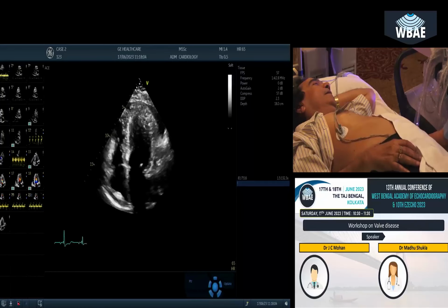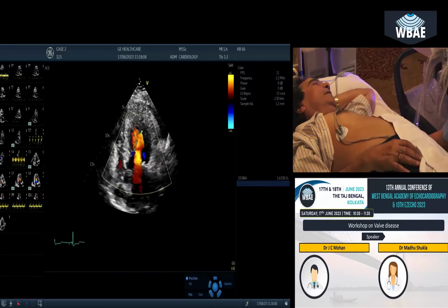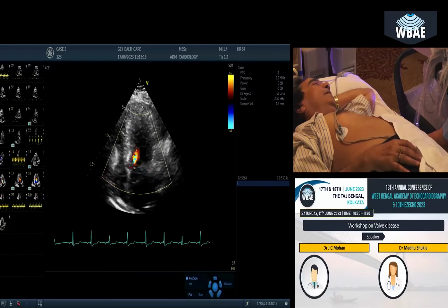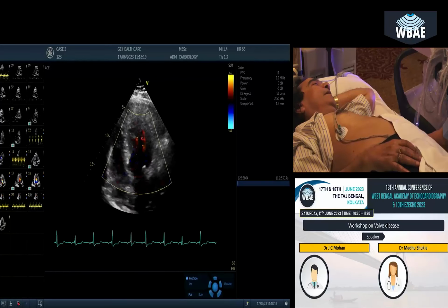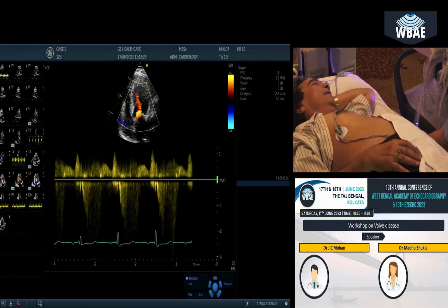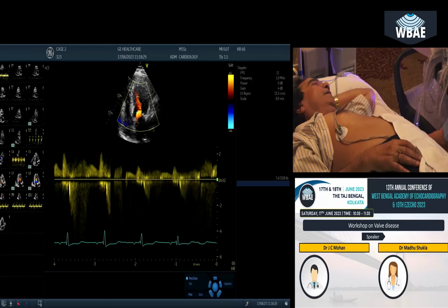Okay. Then, we have seen crypts, we have seen a transmitral flow pattern. Show us any gradient, continuous wave Doppler, rest or provocation. Of course, you should always do provocation. You can do hand grip, you can do Valsalva. Amyl nitrate, I don't know, we keep saying, I don't have amyl nitrate. I mean, how many of you have amyl nitrate? You don't have it. All right.